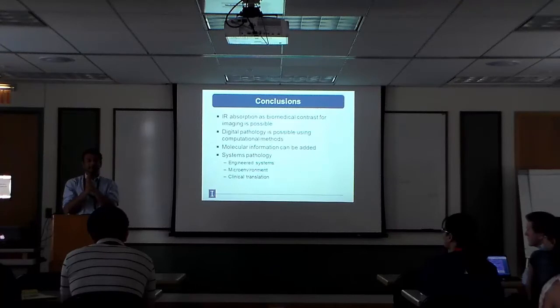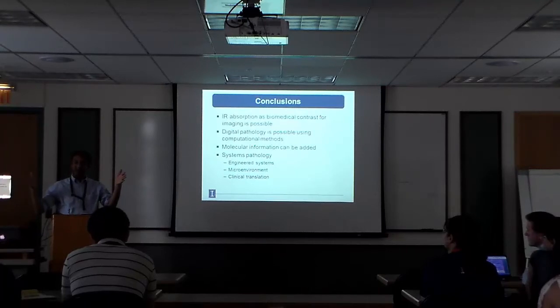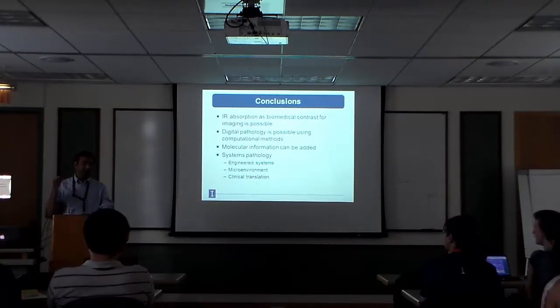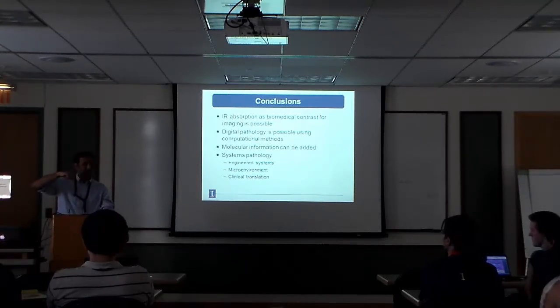That's a good point. The second thing is if you use different frequencies, right? So if you use 10 micron versus 2 micron wavelengths, you'd get different results, obviously, right? Because the first part, if it's within a domain, if it's chemically identical within a domain, you really don't want to separate that domain. So you don't care about that within the domain. You only really care about the edges, right? How sharp you can make the edges in this case.